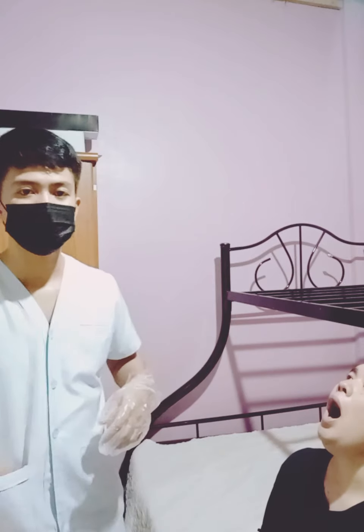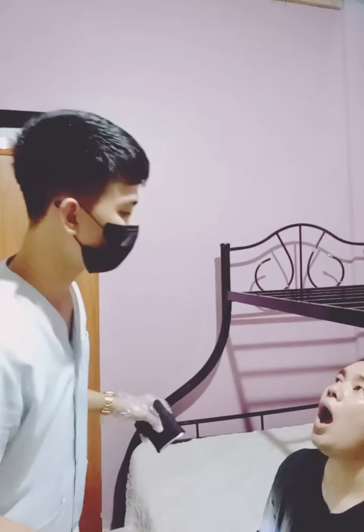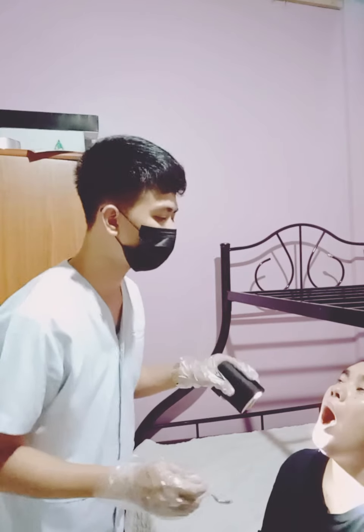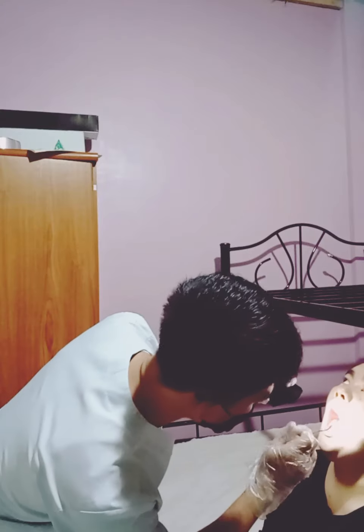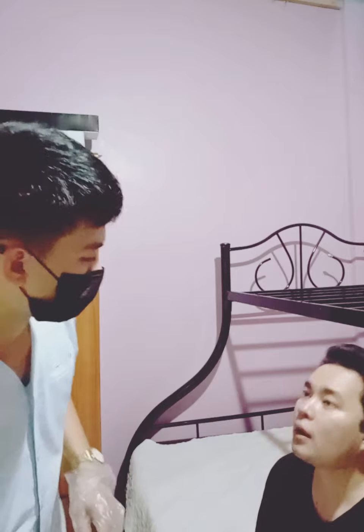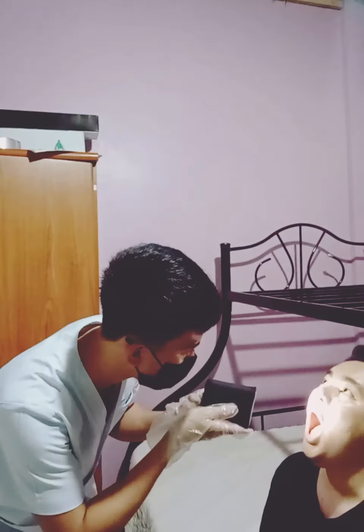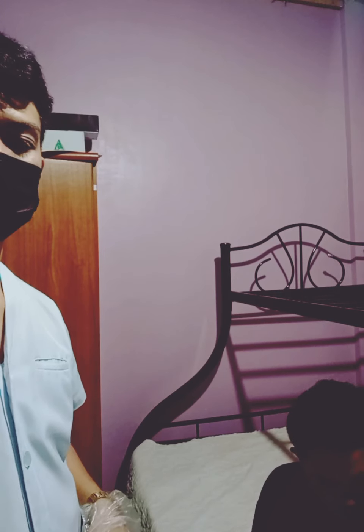Okay. Now I'm going to use my tongue depressor and my penlight for proper visualization. Okay. Thank you, sir. Now, sir, I'm going to inspect your uvula for position and mobility while examining the palate. Sir, would you please say ah? Okay. Good, sir. Now we are going to assess the oropharynx and tonsils.